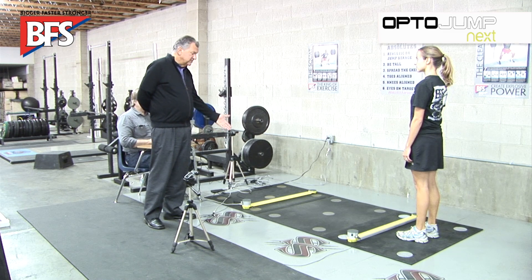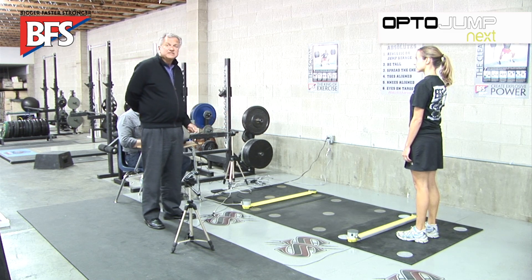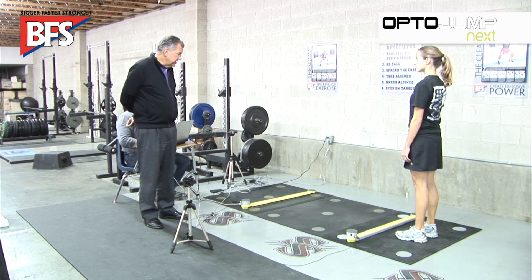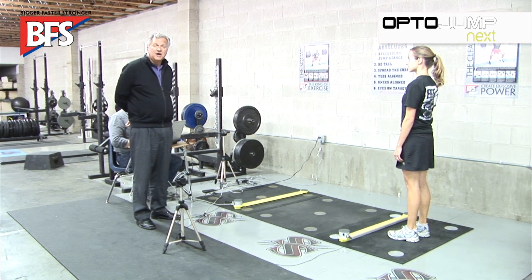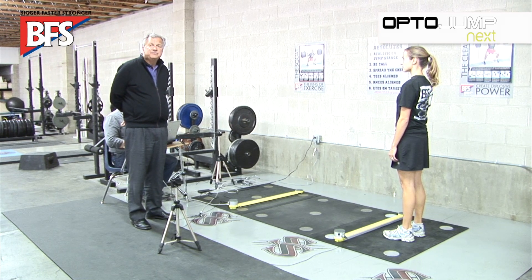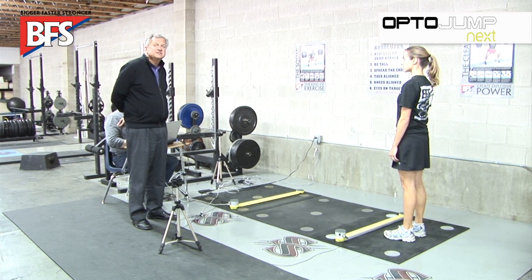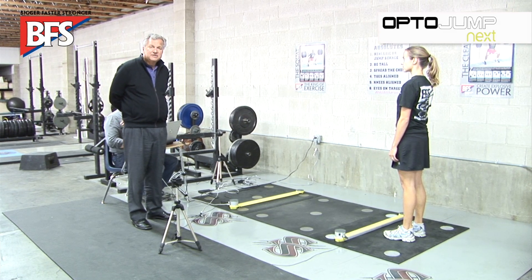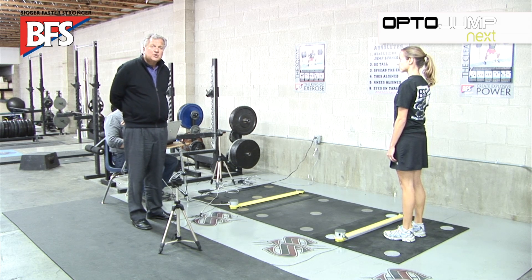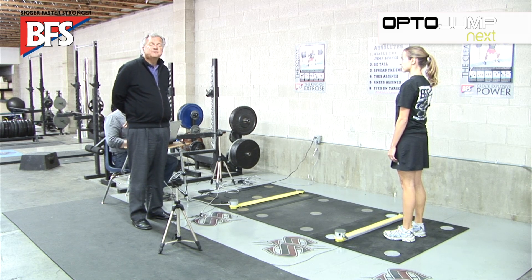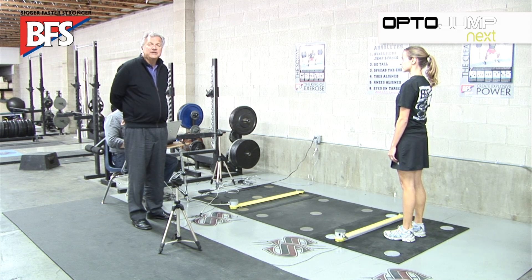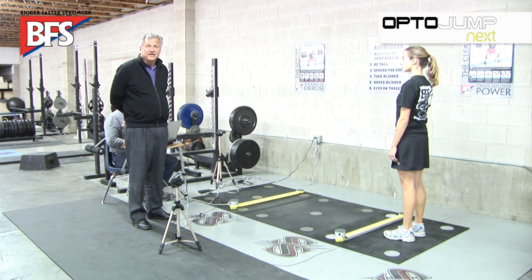I now present the OptoJump system. It's an optical system. Here we have one meter on the floor with 97 beams of light connecting the left side to the right side. As the student enters the system and performs the test, we will be measuring precisely to within a millisecond how well their left foot reacts to the ground — contact on the ground, then flight — compared to their right foot.